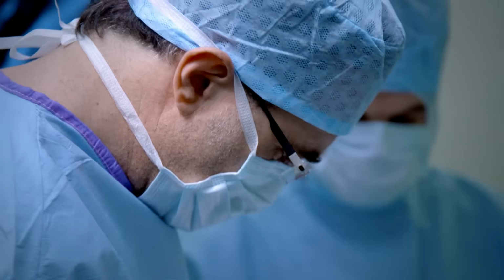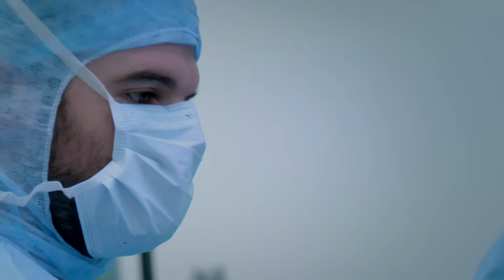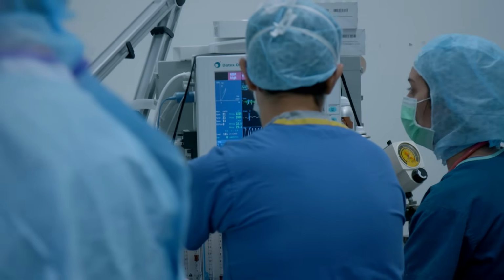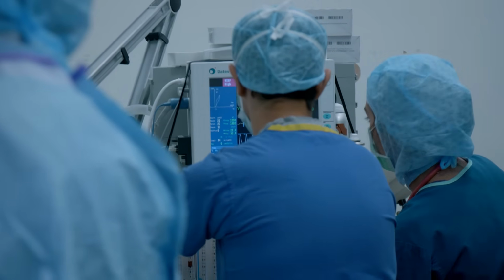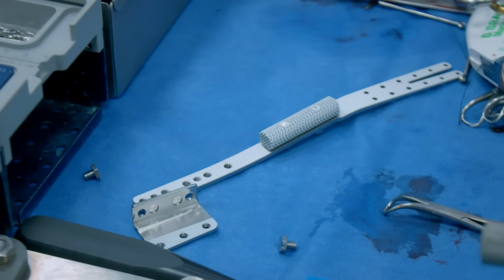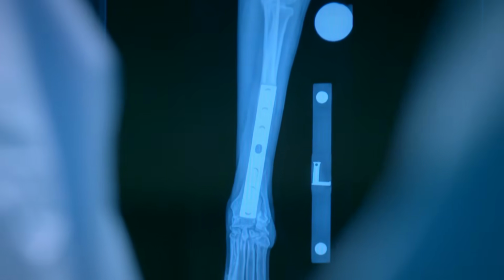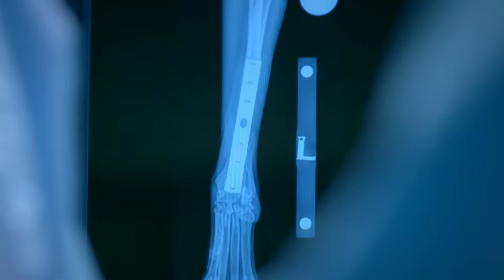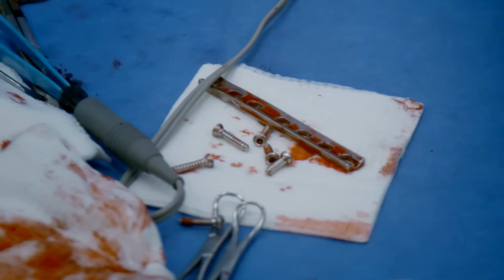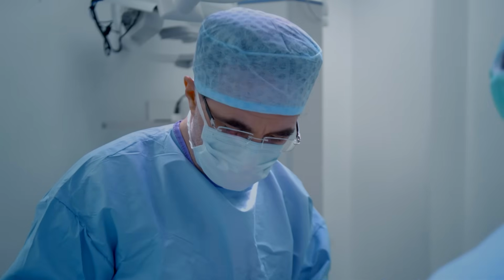We're going to cut in and do our best. We put plates and screws on bone every day. The difference is we have a new special mesh and we have a new way to get the cells to grow into it. And that could be a game changer. Noel takes out the plate that was put in when Izzy first broke her leg. Here we go. Implant coming out. This will be sent to the lab to check whether the bug that caused Izzy's catastrophic infection is still there.